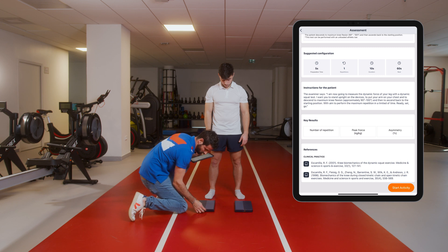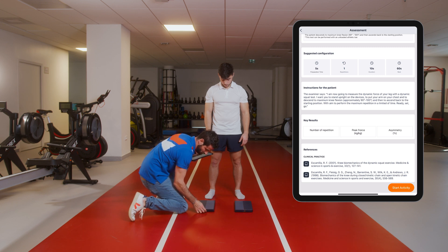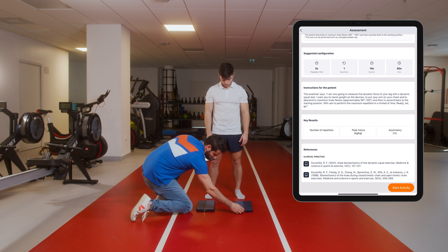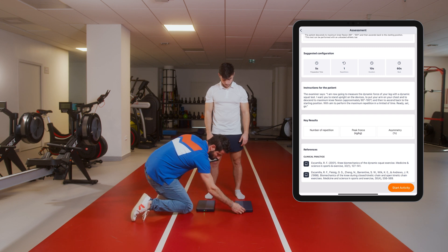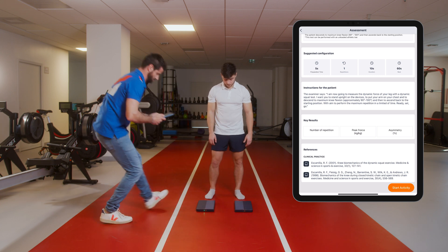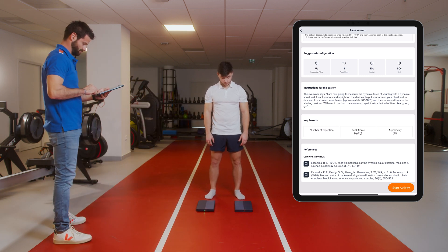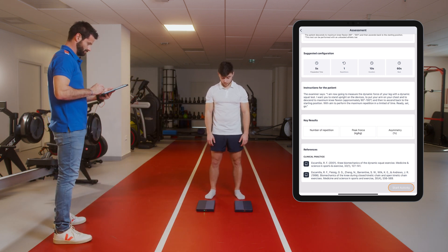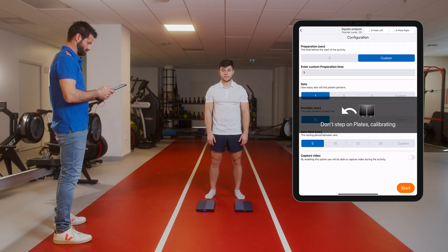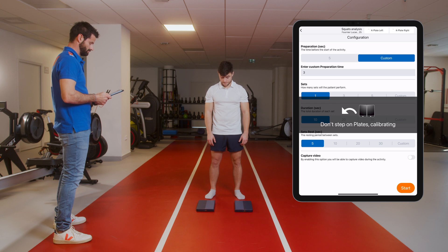First, make sure your patient is correctly standing on the plates, meaning they have to adopt the position that is the most comfortable for them to do squats. Set the plates according to the space between their feet.